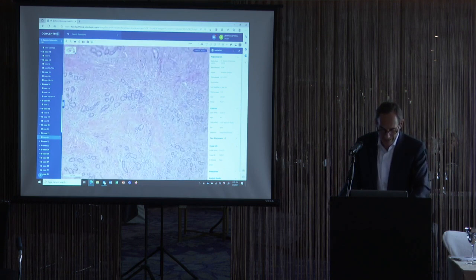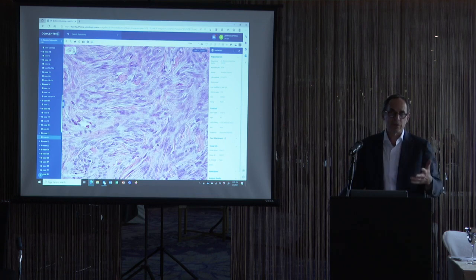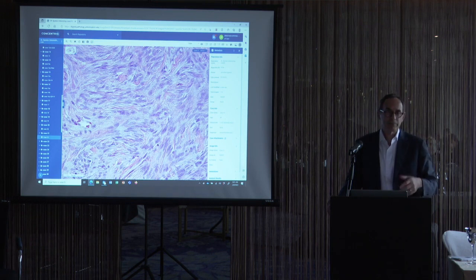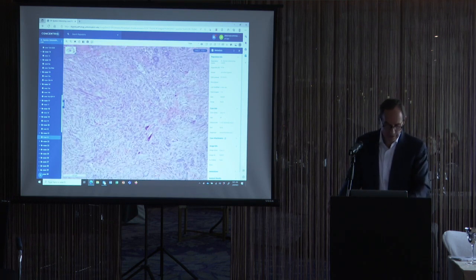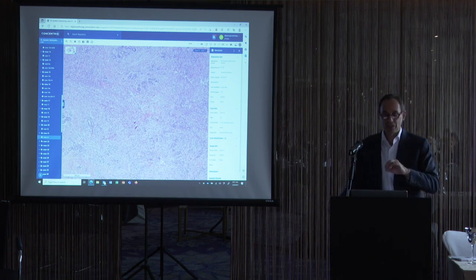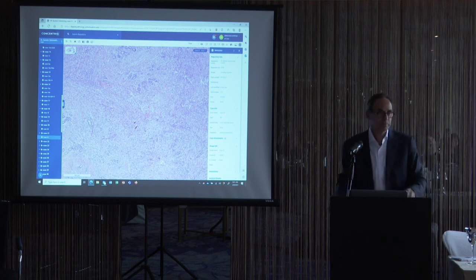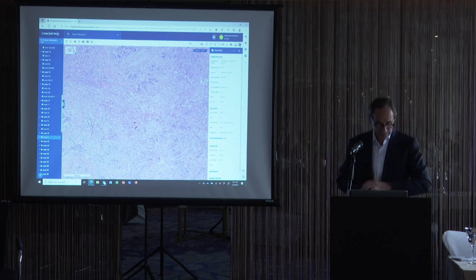We also have this cellular fibrous tissue that's basically indistinguishable from a fibrothecoma in the ovary. So this would be a Sertoli fibrothecoma. Totally benign. The most important stain that you want to do with these sex-cord stromal tumors is SF1. A lot of these are inhibin positive, but inhibin can be negative. Steroidogenic factor 1 is much more sensitive and is the best marker for sex-cord stromal. We'll stop with that. Thank you very much.